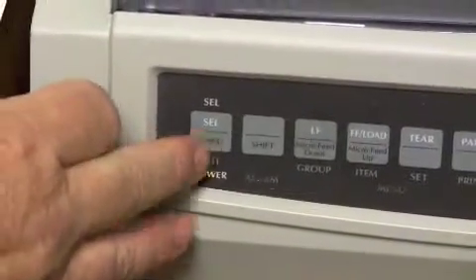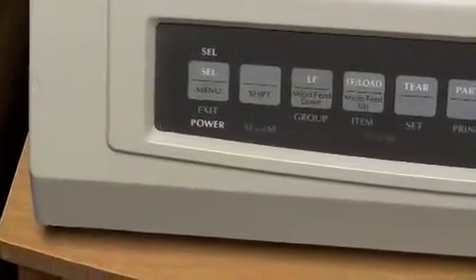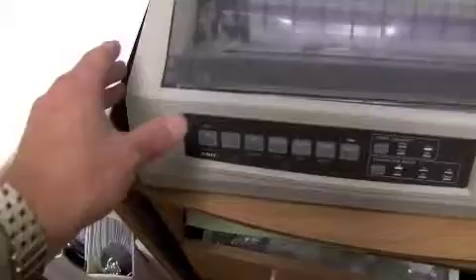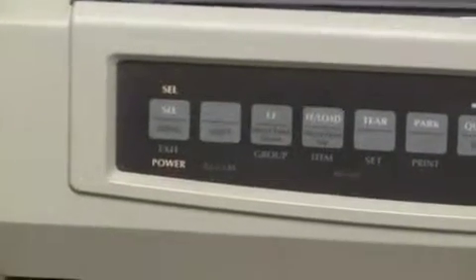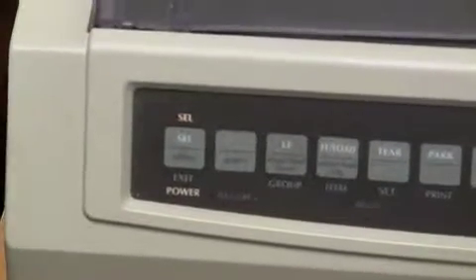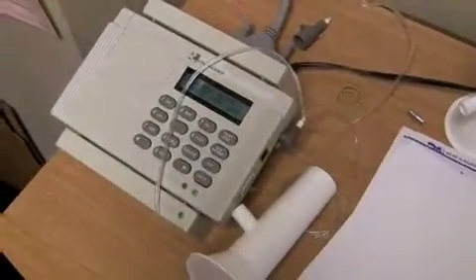Okay, here are the buttons on the printer, and you always have to hit that very first button, the leftmost button. So basically push this button. And if you can see, I'm not sure, but the select part has now lit too. So the printer is ready to go when SEL is lit up above the button and power lit up below the button. And from that point, the PFT machine will guide you through what you need to do.